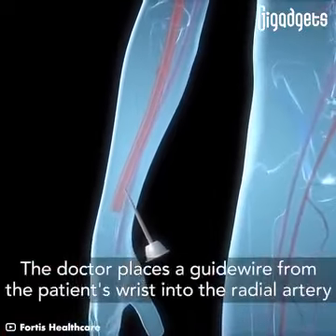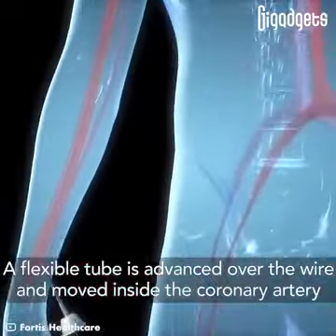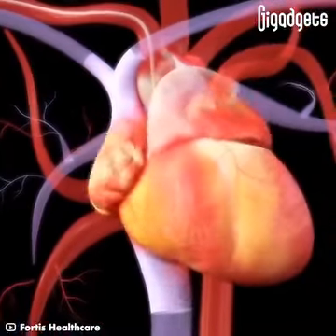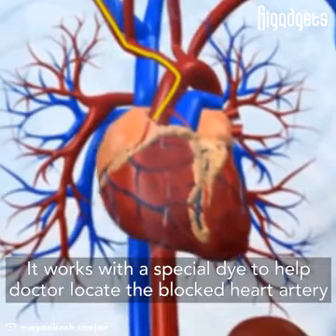The doctor places a guide wire from the patient's wrist into the radial artery. A flexible tube is advanced over the wire and moved inside the coronary artery. It works with a special dye to help doctor locate the blocked heart artery.